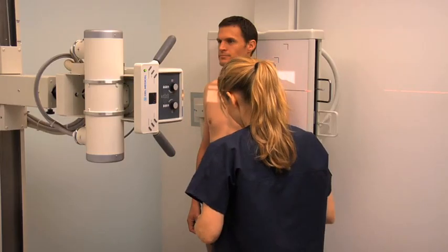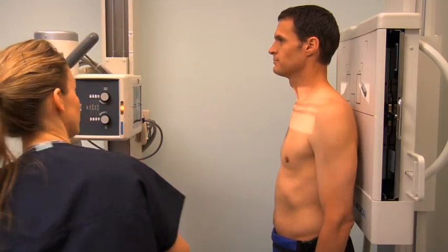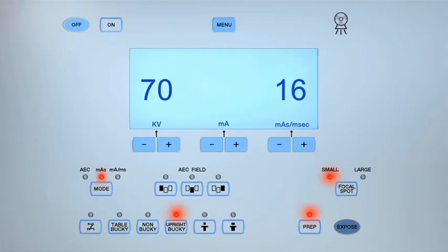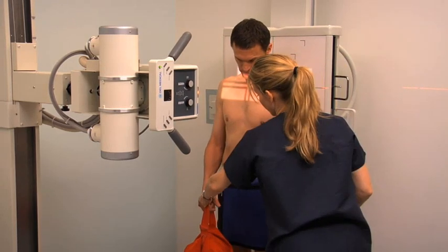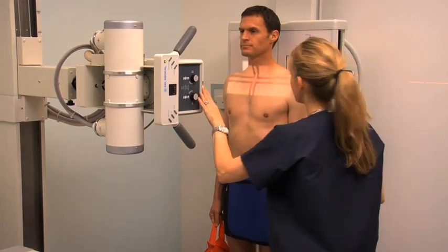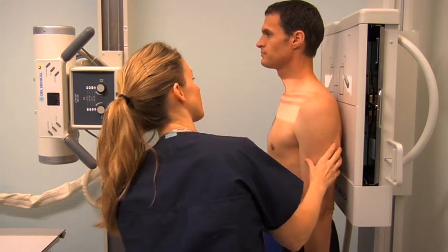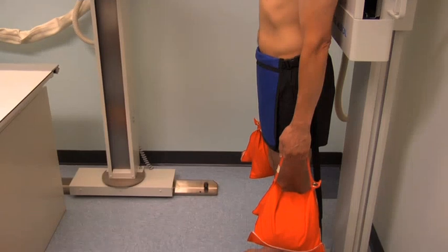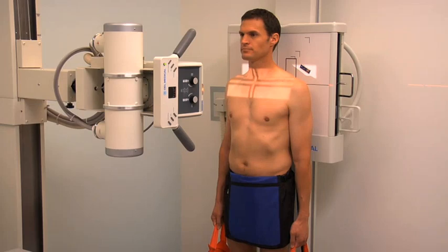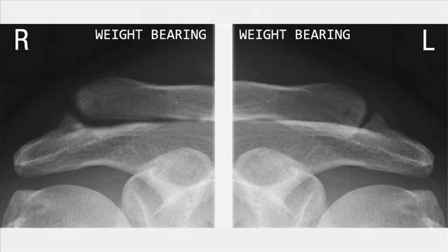Collimate the light field to include both AC joints and the surrounding soft tissue of the shoulders. Place the appropriate right or left lead marker. Ask the patient to remain still and hold their breath on expiration. Expose and process the cassette. For the weight-bearing projection, the patient remains in the same position and is given an eight to ten pound weight to hold in each hand. Confirm that the collimation and central ray are positioned as for the non-weight-bearing projection and place a weight-bearing marker in the collimation field. Instruct the patient to relax their shoulders and arms and let the weights pull their arms down. Expose and process the cassette and perform image analysis on the images obtained.